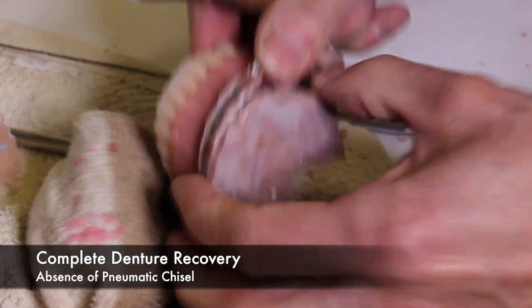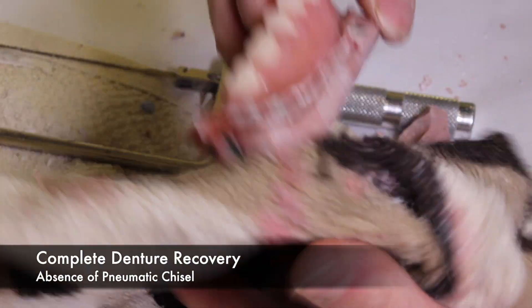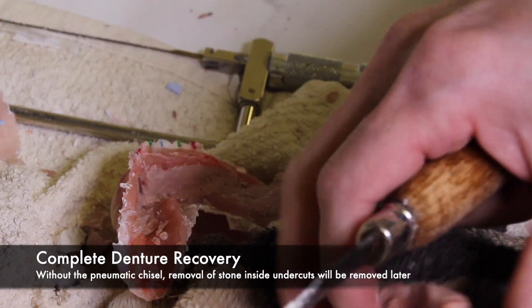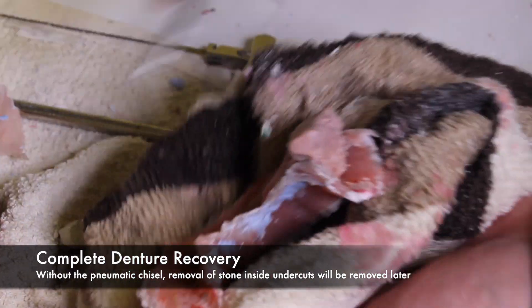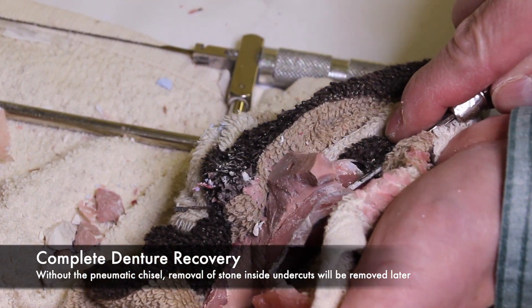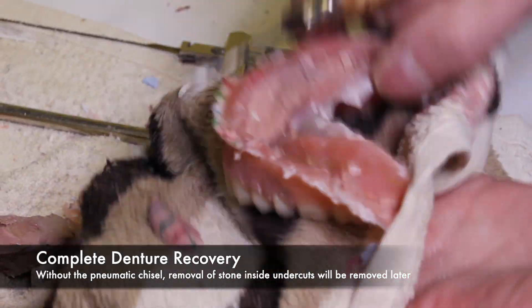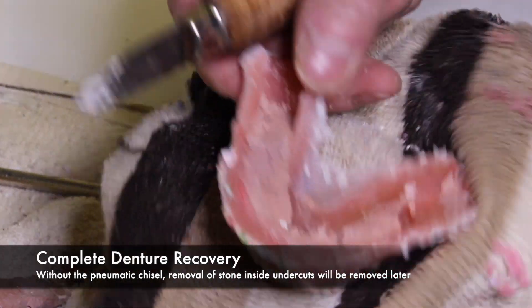In doing this, always be careful and pry from all angles. If you only pry from one angle, you have a high probability of fracturing the denture. What can happen is large pieces of stone may remain inside the undercuts within the denture. In this situation without a pneumatic chisel, we're going to show you how to remove these pieces of stone later on.